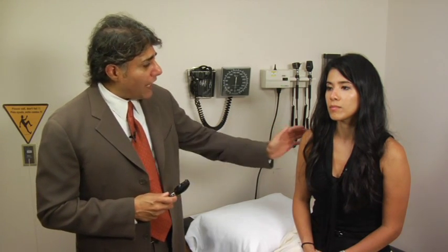I'll also like to ask Dr. Zhao if it's okay if I put my hand on your head. And this is very helpful because when I start from a position back here and I work my way forward, I don't want to inadvertently have my head hit her head. It's also very important to remember that when you're examining a patient's right eye, for example, as I'm doing with Dr. Zhao, that I use my right eye as well. If I were to examine her with my left eye, and as I got closer to her, it would become a very awkward position. So right eye, examining the patient's right eye, my left eye, examining the patient's left eye.